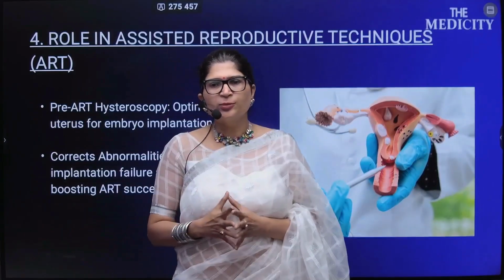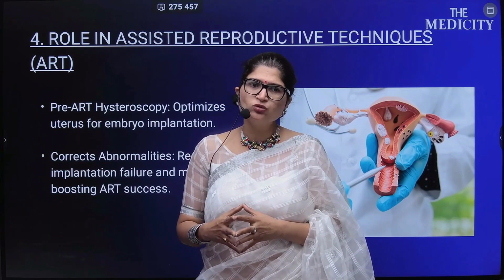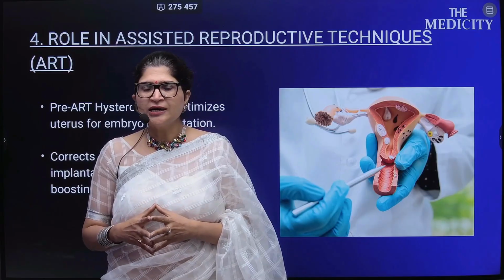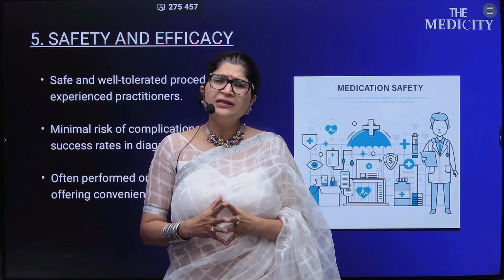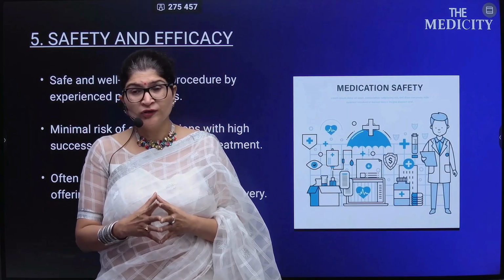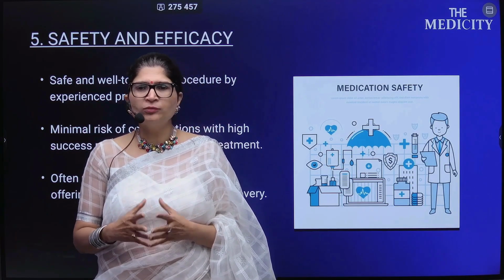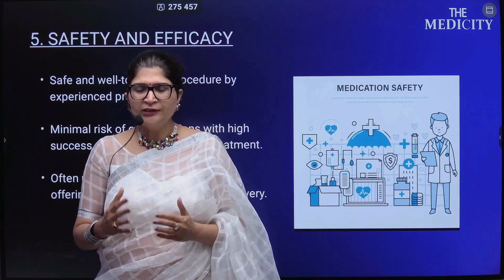Now, the role in assisted reproductive techniques, as we say ART. Pre-ART hysteroscopy optimizes the uterus for embryo implantation. It corrects abnormalities and so reduces the chances of implantation failure and miscarriages, and it boosts ART results. Now, if I talk about safety and efficacy, it is very safe and well tolerated by patients. When handled by experienced practitioners, there are wonderful results, minimal risk of complications, and a high success rate in both diagnosis and treatment. It is often performed on an outpatient basis, offering convenience, shorter recovery, and less downtime.